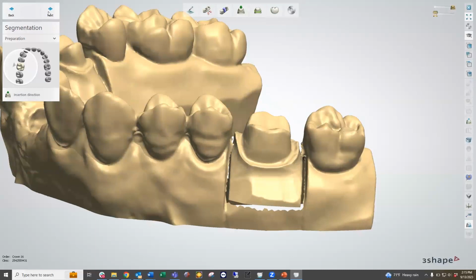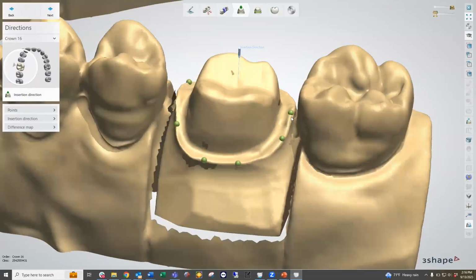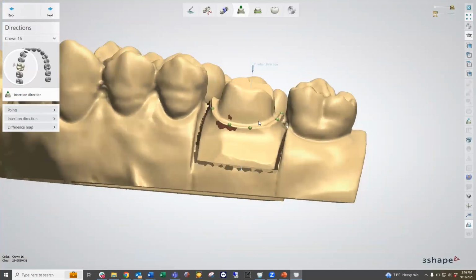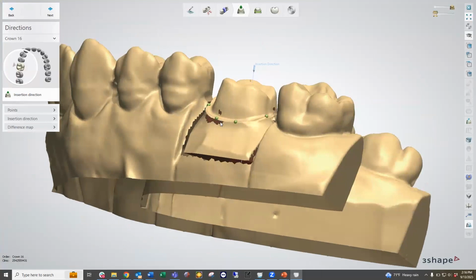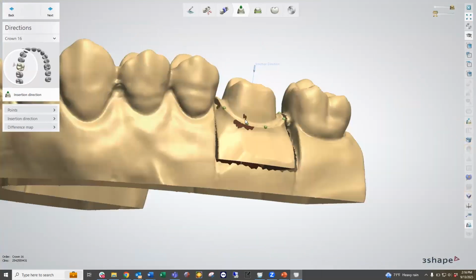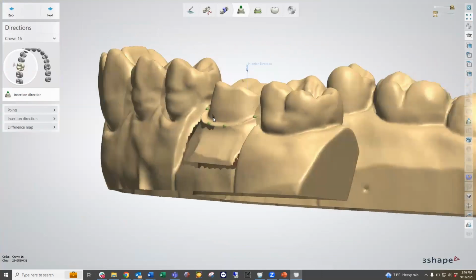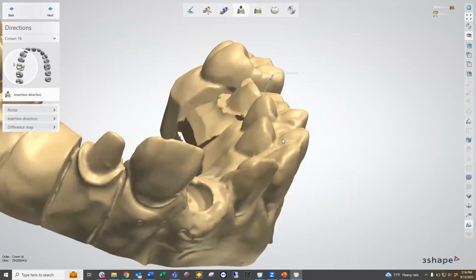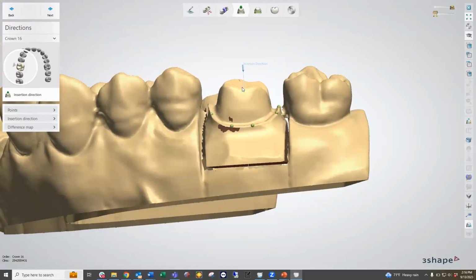Next, we're going to move on to the direction stage. And the direction stage has basically one aspect here, which allows us to see the path of insertion for this unit. If you can see on the path of insertion, we do have these red highlighted areas. These are going to be your undercuts relative to this insertion path. As we rotate around, we can see those highlighted areas take place, but we can also see the relative direction of the insertion path as we see here.